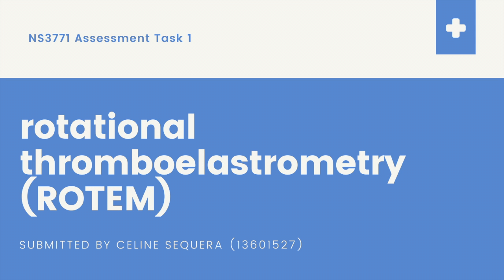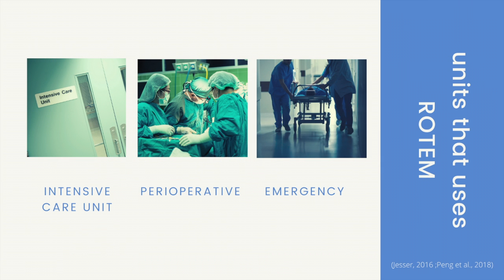Good day, my name is Celine Sequeira, and today I will discuss rotational thromboelastometry, or ROTEM. ROTEM is usually found in ICU, emergency and trauma units, and in theater.